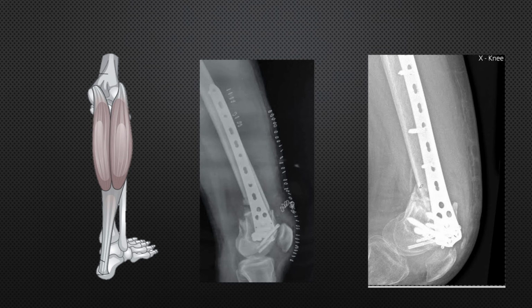Now if you see this fragment, these ridges are kind of pillars. If you don't stabilize them, they are going to displace. They are the insertion point of the gastrocnemius, and also the forces are directly transmitted to these condyles when the patient bears weight. So you have to put some kind of neutralization implant in this zone so that the shear forces are neutralized like this.